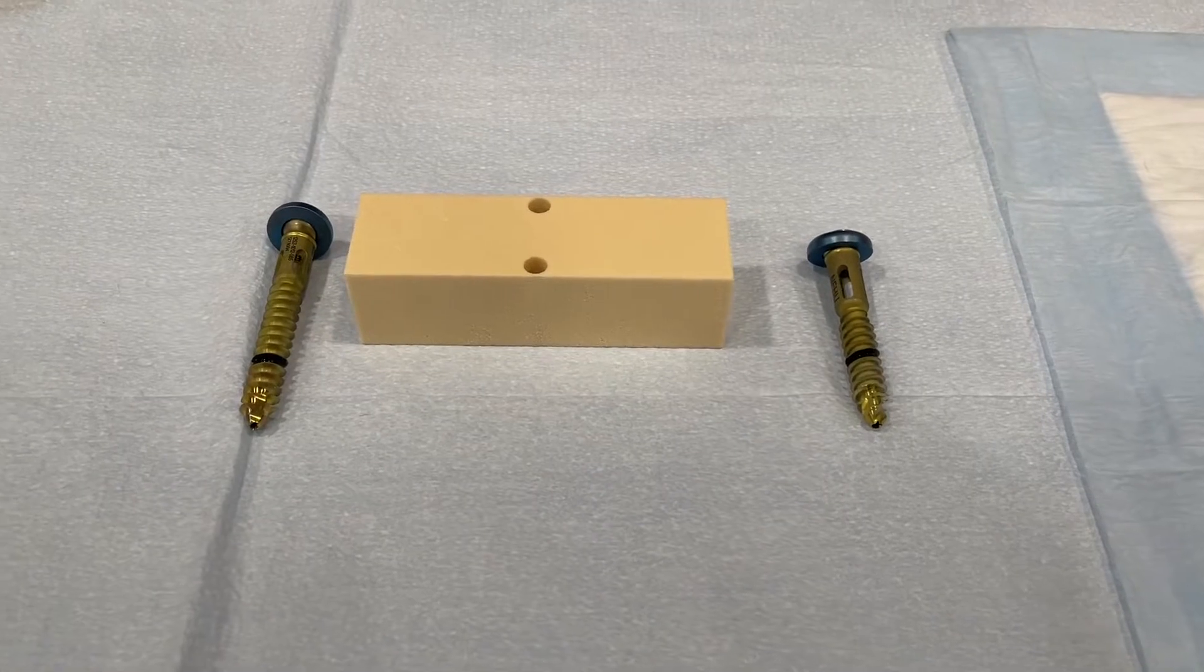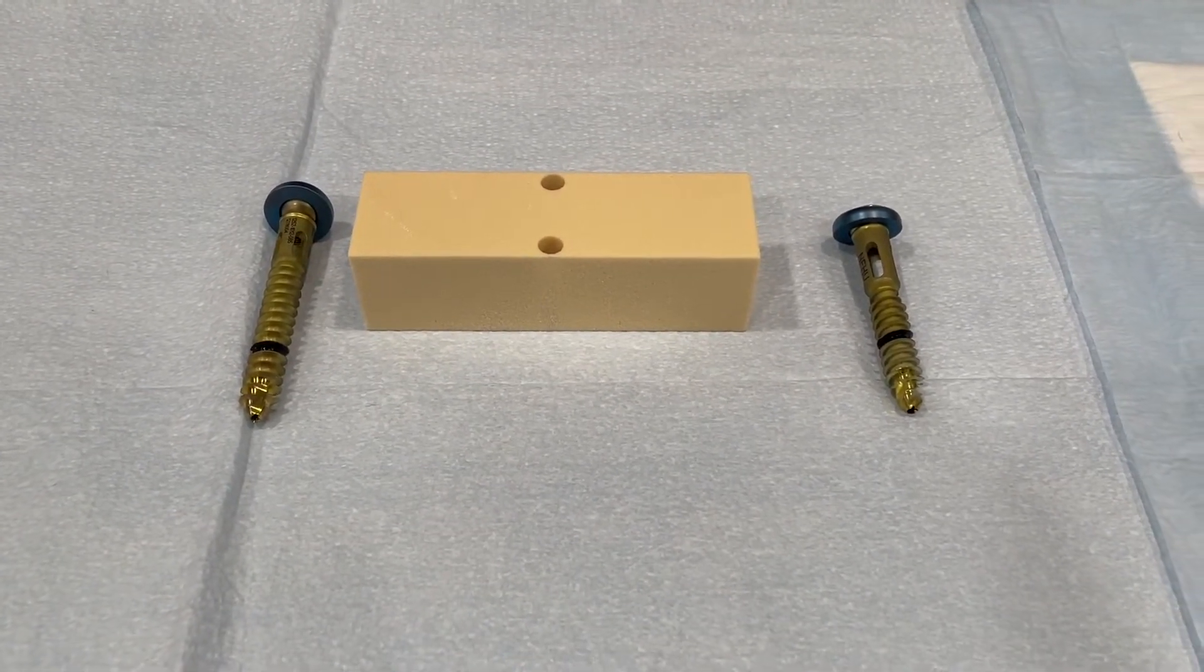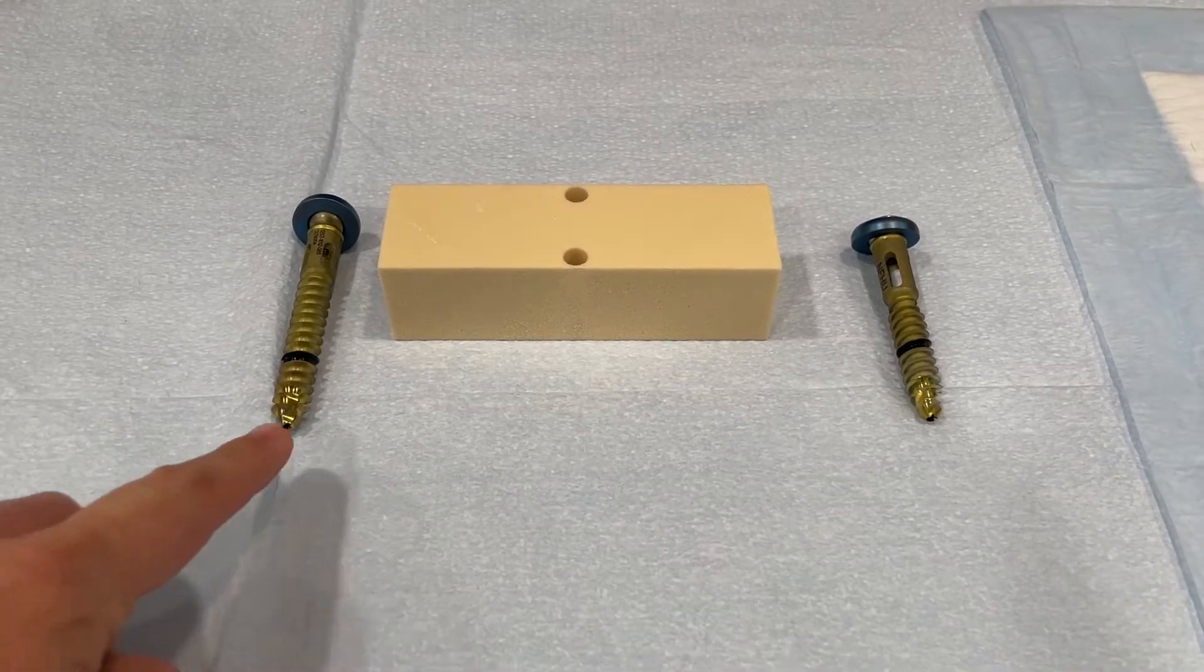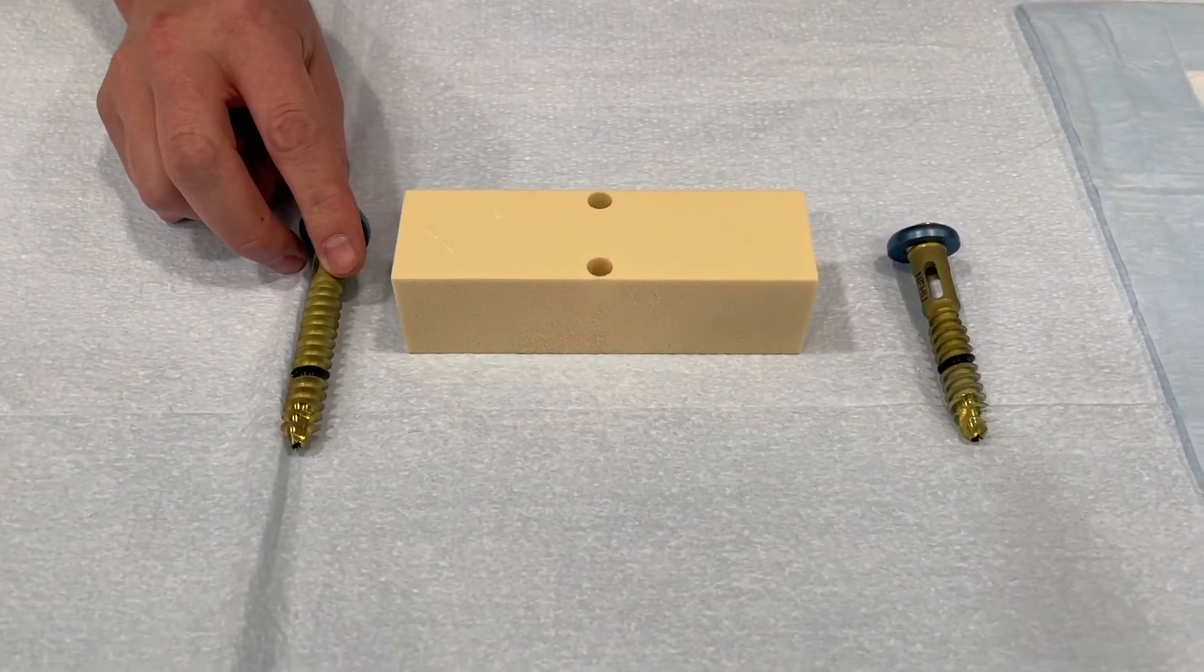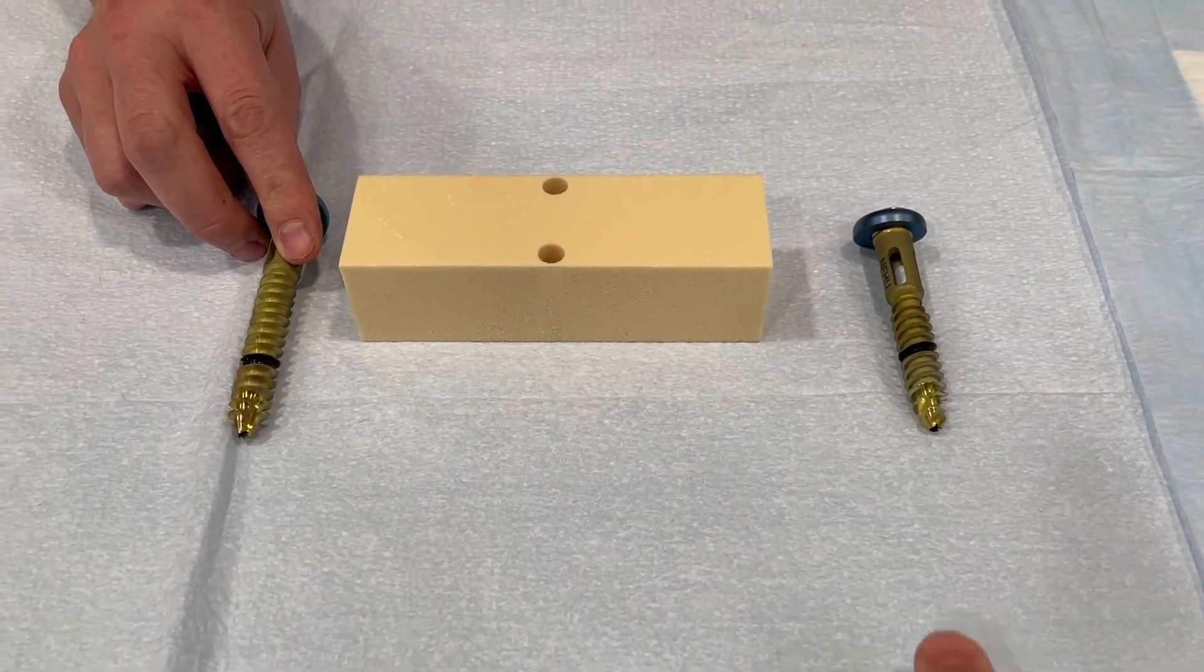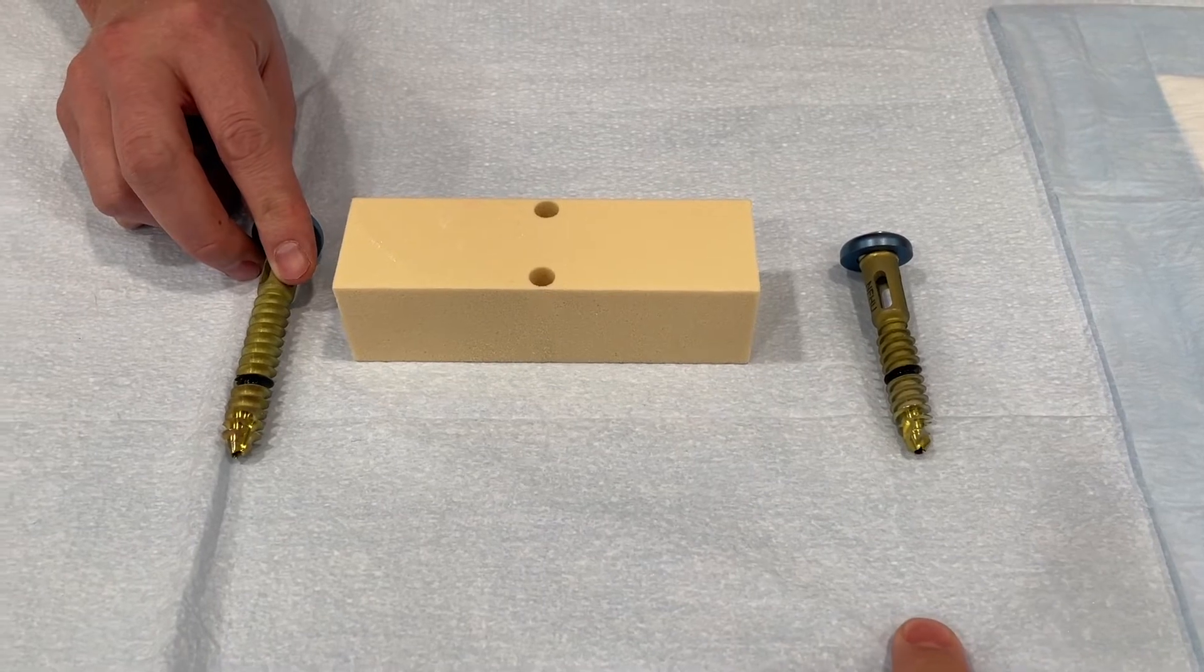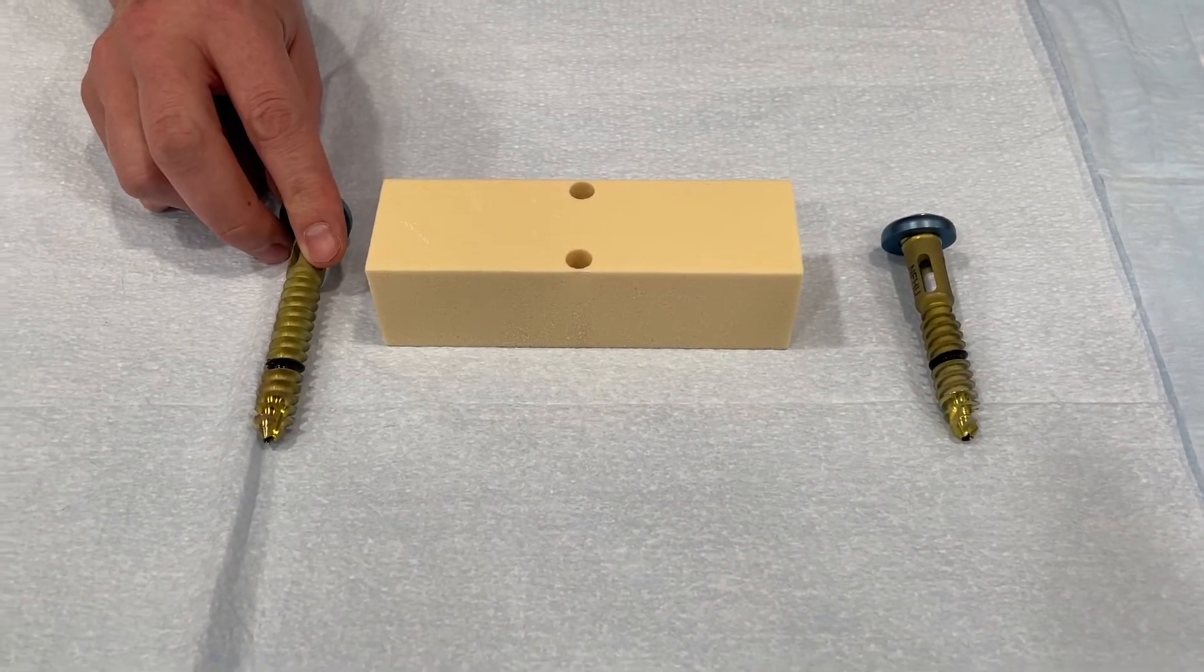Now we're going to do a test in this 15 PCF foam that mimics cancellous bone really well. We're going to put in a standard buttress style screw to show how a normal wedge style screw works in the bone, and then we'll do the exact same test with the UniFi MI and show the difference between a normal screw and a mechanically integrated screw.